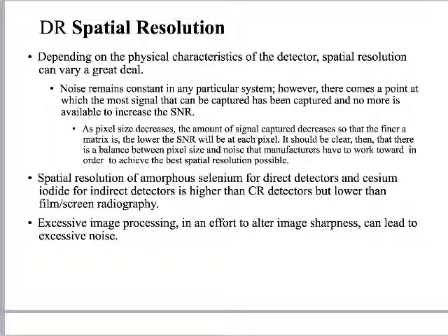Okay, so the last thing we're going to talk about real quick is spatial resolution as it relates to DR, right? We talked about spatial resolution as it relates to CR, and we said it was hampered a little bit by the fact that we're reading out the light with a photomultiplier, right? So we can have a big variation in spatial resolution in digital systems. Why do you care? Well, at some point, probably in the next 5 to 10 years, if you continue in a career in radiography, someone's going to say, hey, we're thinking about updating room number 2, right? Which one of these machines do you think is the best one, right?